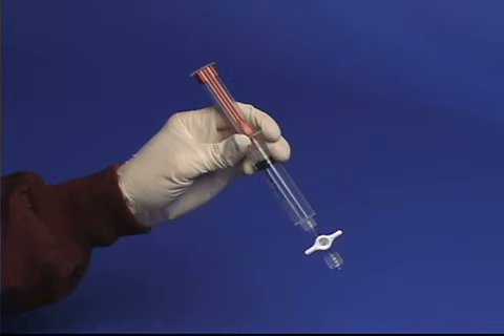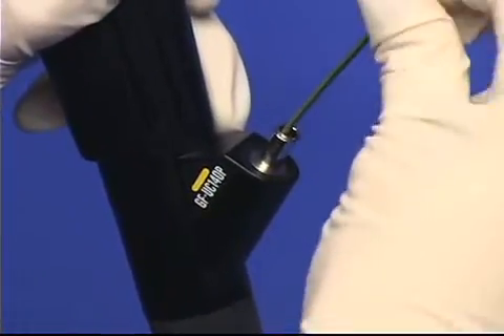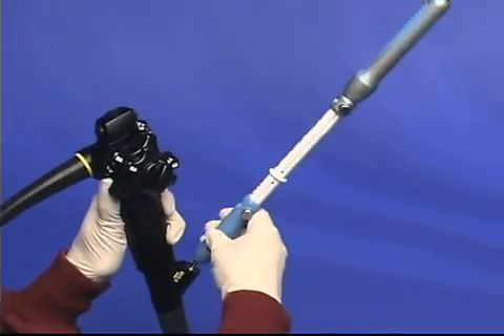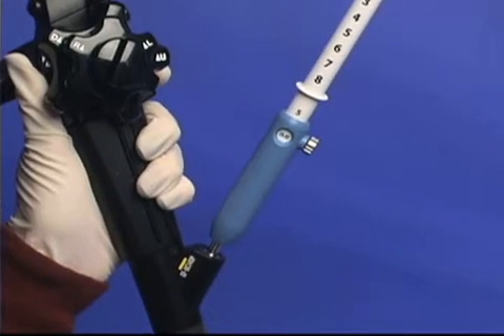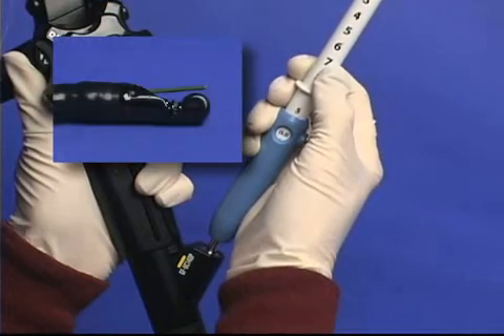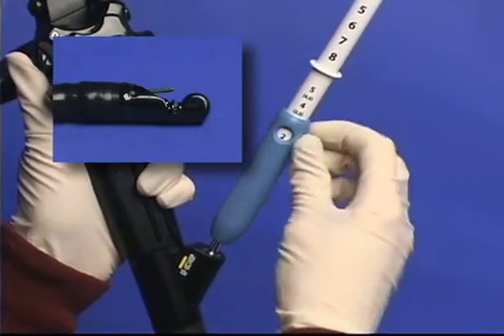The syringe can then be set aside until aspiration biopsy is desired. Advance the device into the endoscope to determine preferred sheath length. To adjust the length, loosen the thumbscrew on the sliding sheath adjuster and slide it until the preferred length is attained. Then tighten the thumbscrew.